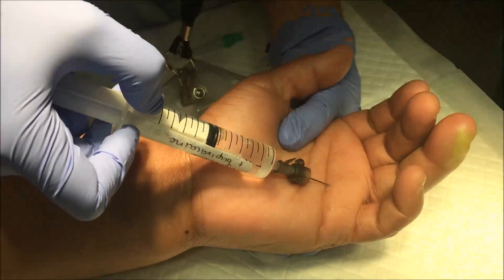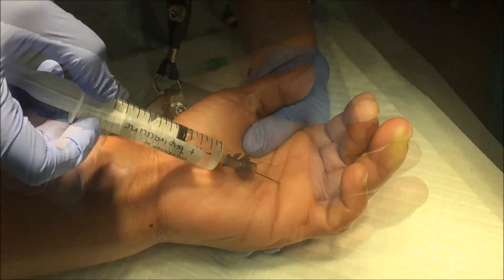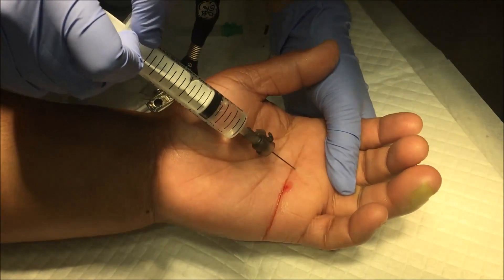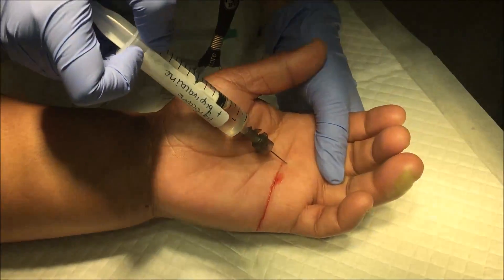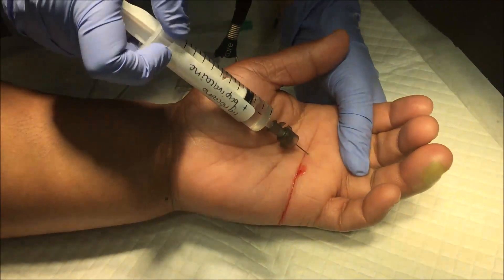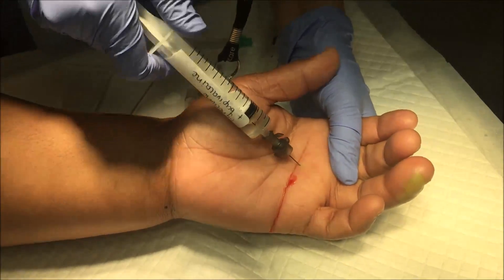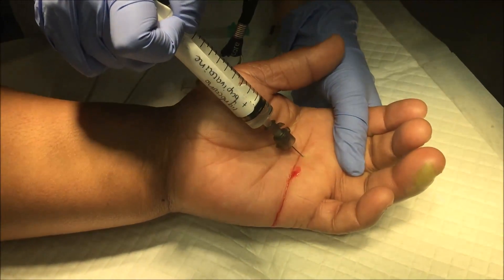This nerve block could technically be achieved by using 2 injection sites — after anaesthetizing the dorsal nerves, angulate the needle towards the palmar surface and inject there to anaesthetize the palmar surface as well. In this video we performed a 4-sided ring block for completeness. You want to aim to inject about 2–3ml of local anaesthetic at each injection site to ensure adequate anaesthesia is achieved. Once your block has been performed, the finger should be completely numb and the procedure can commence.